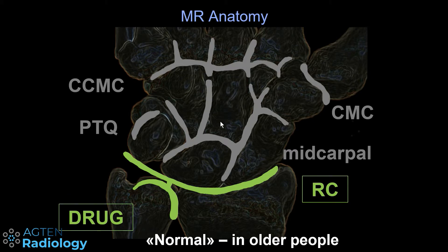A communication between the distal radio-ulnar joint and the radiocarpal compartment can be considered a normal finding in elderly people — I would say above 40 you can find this as a normal degenerative process through small perforations in the TFC. If it's in a young adult then clearly it's probably a traumatic injury, but not in elderly people. Frequently they are also on both sides, which is another hint that it's just a normal degenerative process.